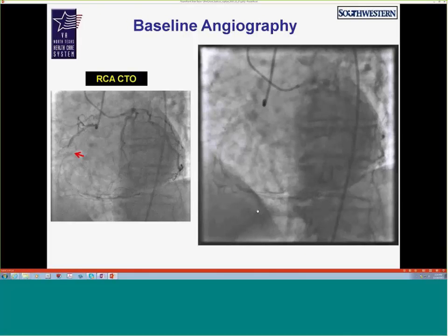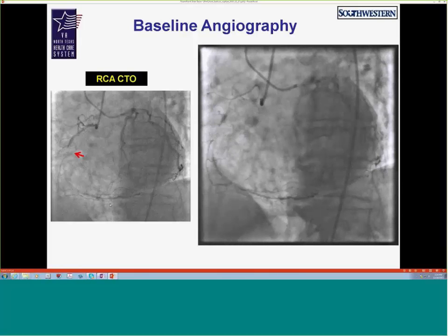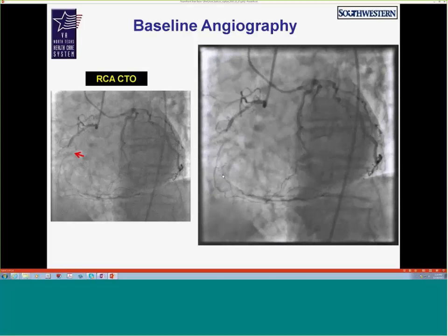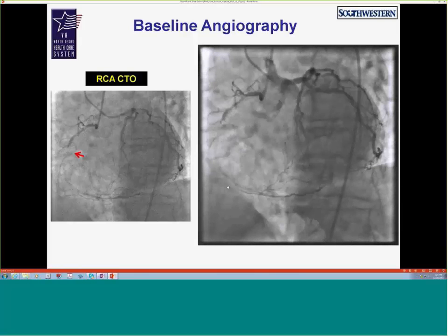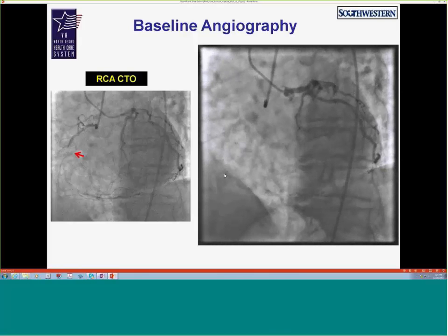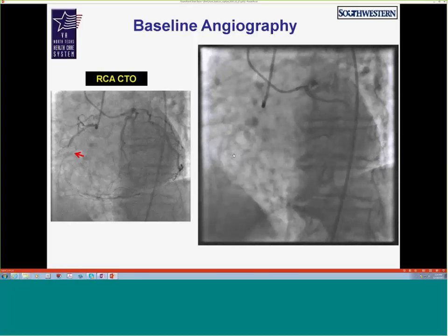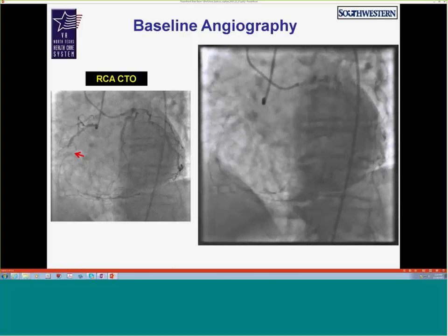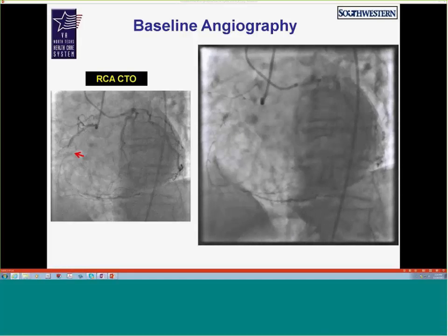And does it bother you, the fact that it's very calcified distally, and you have all this calcification in the distal part of the vessel? So this is a very calcified artery. And the problem with that is if you go subintimal, you might have a little more difficulty in the entry. Would that be a factor in choosing the initial strategy, or you would still go antegrade wires anyway? Well, I think your point is well taken. And of course, that's correct. But since the occlusion is short, I would probably try an antegrade approach first. Sure, and I completely agree, actually. That's what we did here.